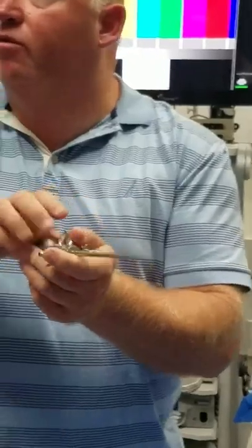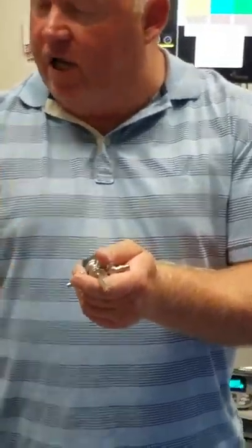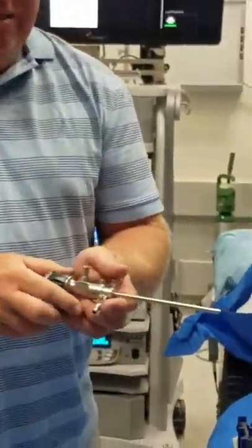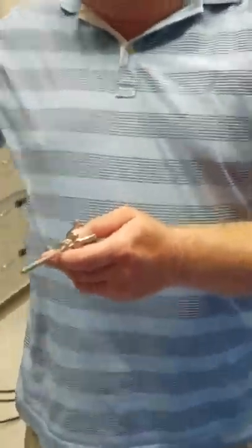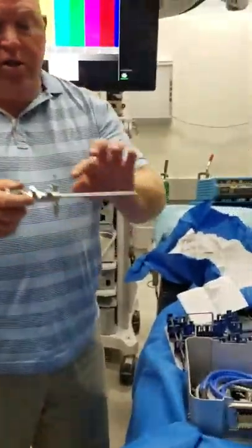Why do you want that? You want to push fluid away from the camera. You don't want stuff coming to your face. You may have a suction coming out the other side, or somewhere else, but this pushes fluid away from the scope so you can see something. Some doctors will do outflow and inflow, but most doctors put inflow through here, push fluid away, and then have outflow somewhere else, either up by the top of the knee or in the shoulder somewhere else. So it's a cannula.